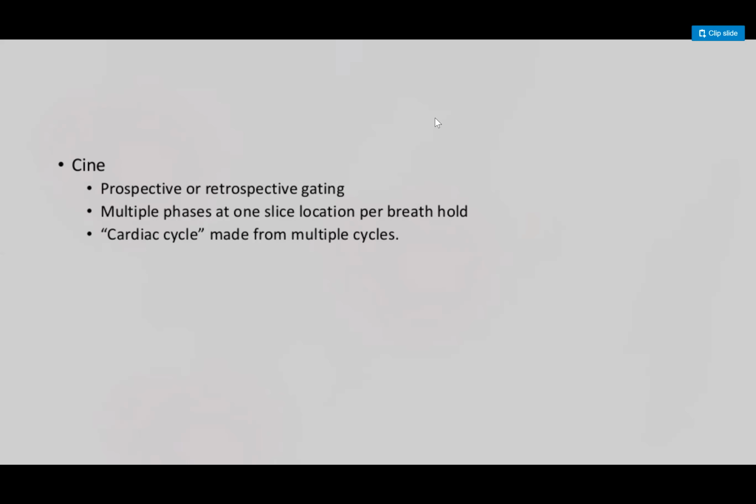The issue with that is that the myocardium becomes very black. It doesn't stay gray, and many of the things become darker. The other thing with T2 is you have to have a longer breath hold, and it doesn't give you really crisp images as T1 weighted does, because the time to echo is shorter there, so you can get more pulses and more information and a nicer image.